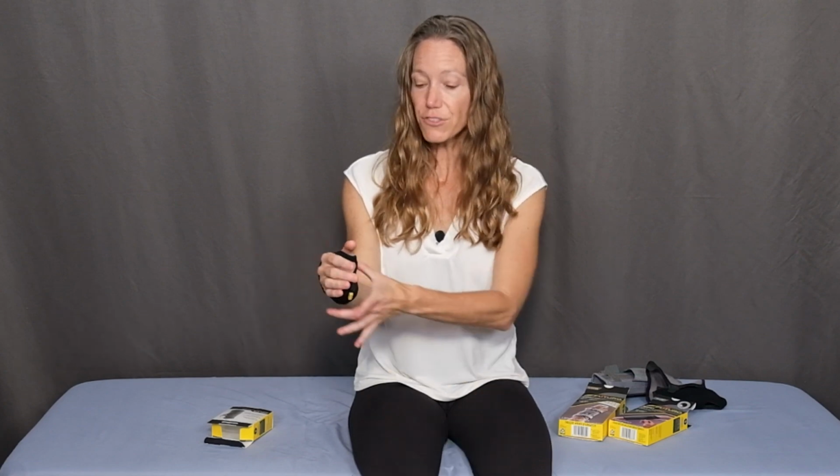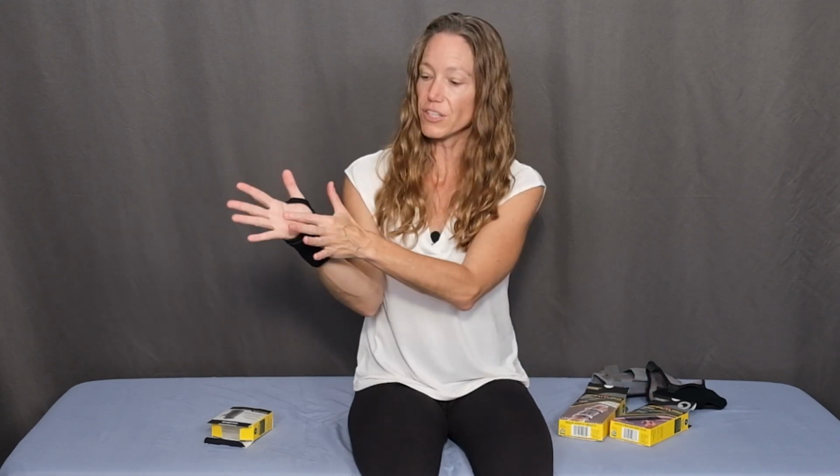So I can move my wrist a little bit, and the support does feel about the same as the second one. What's great about this is there's no bar across my hand. So as I mentioned, I would be able to hold tools. I could use a tennis racket. I can do a lot more activity with this brace than I could with the second brace. So just a different style.